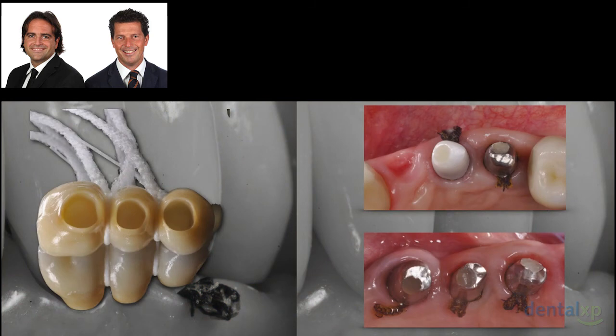Using appropriate retraction cords and superfloss in the bridges and abutments would help to remove all the cement excess, avoiding soft tissue inflammation. It is crucial to remember that cement residuals could be dangerous, especially around the implants, causing peri-implantitis over time.